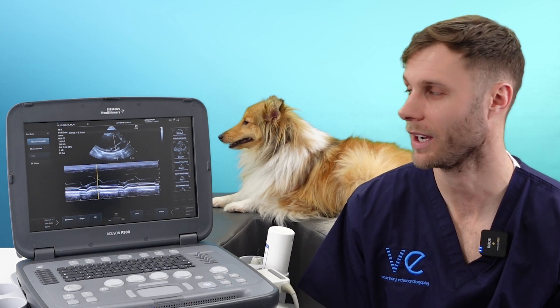EPSS is a great and easy tool. It's very reproducible and gives you an assessment of left ventricular function. However, there are lots of other pathologies that can affect the result — for example, if your patient has aortic regurgitation, mitral stenosis, or left ventricular hypertrophy, we wouldn't recommend using this tool to assess function solely.